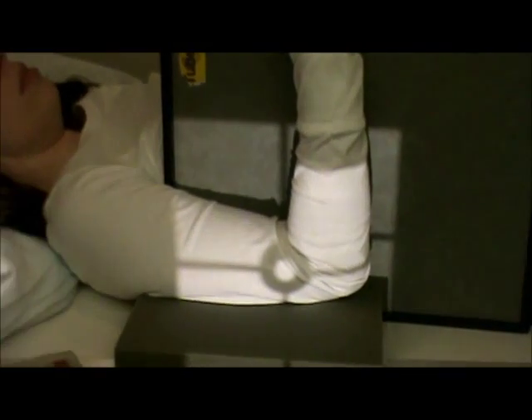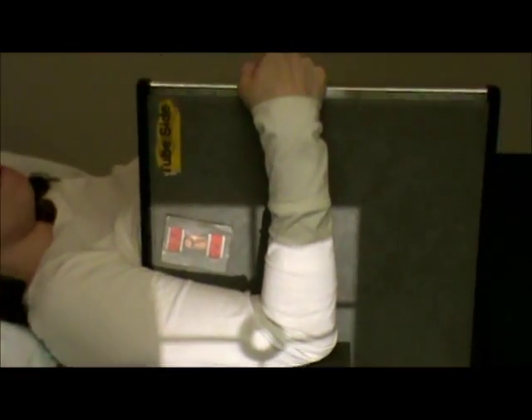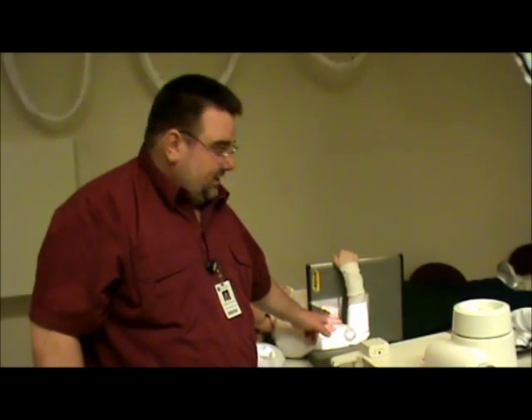I've got as far up as I can — I think I need to come in just a tad bit more. I've got past the elbow and I'm just to the top of the film, so I'm not exposing anything I don't need to be exposing. The marker placement is going to go on top here — right arm. We have as much of the humerus as we can, which is the distal third, which is what we want to see.